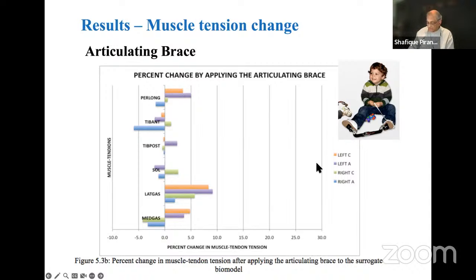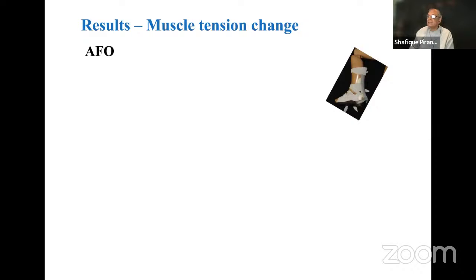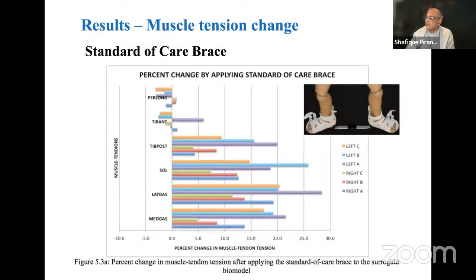So I wanted to show you that so that you would understand that the standard of care bracing needs to be this unfortunately difficult brace that holds the foot in this position. Dr. Ponseti worked this out 30 years ago, and we're still having to learn the message over and over again. This is why this brace is so important, to maintain the stretch and to hopefully prevent relapse. The longer this brace is worn every day, and I don't know exactly how many hours, but at least a certain number of hours every day, the less likelihood it is that the clubfoot will relapse.